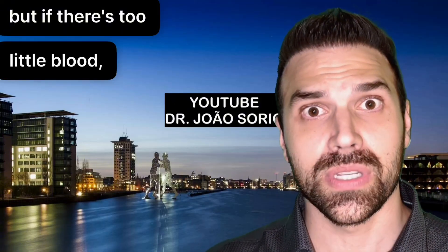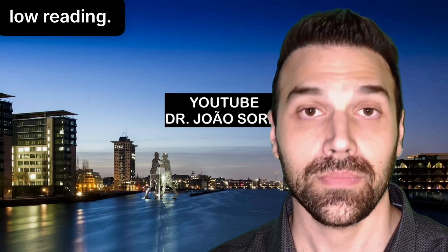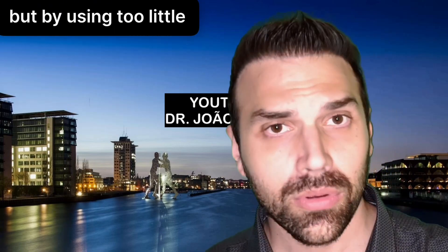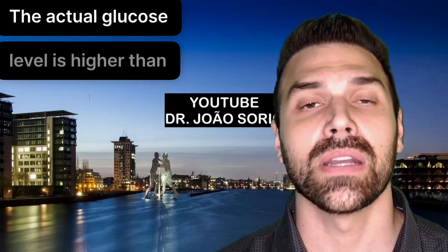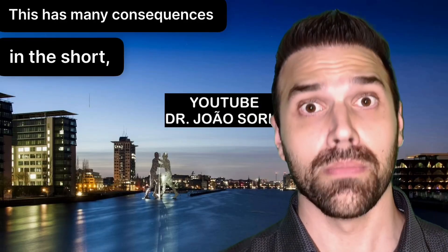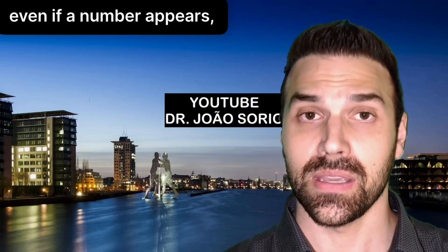The answer is that it can give an error, but if there's too little blood, the device might still take a reading and give a false result — a falsely low reading. Your glucose might actually be high, but by using too little blood, you could get a falsely low number on the display. The actual glucose level is higher than what's showing, with consequences in the short, medium, and long term.